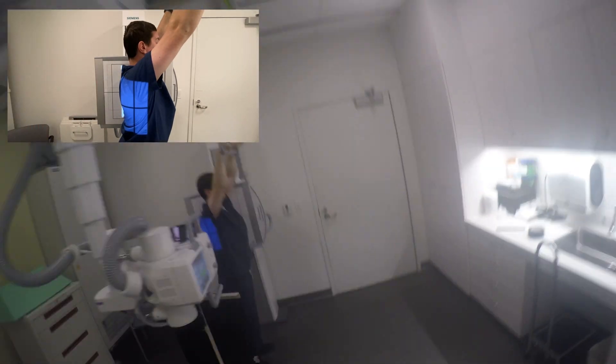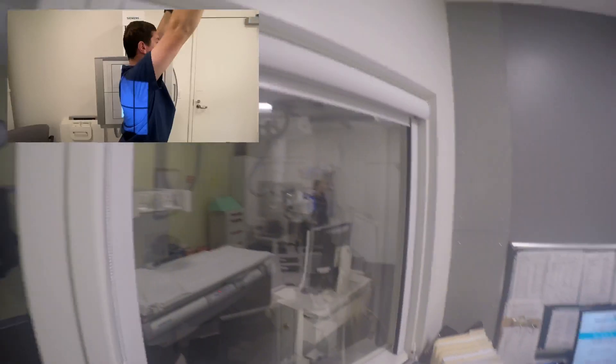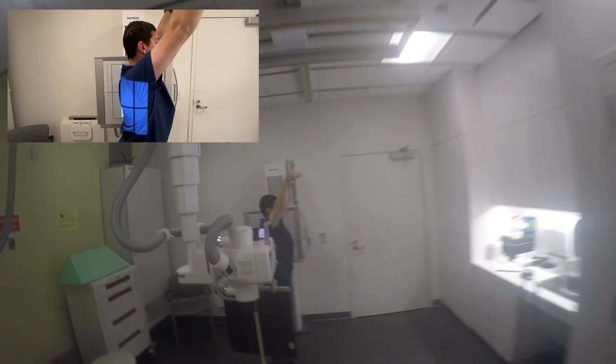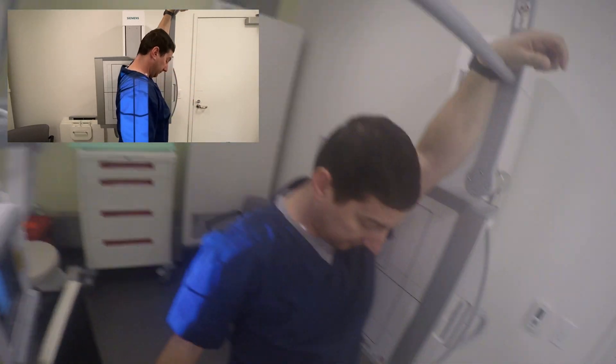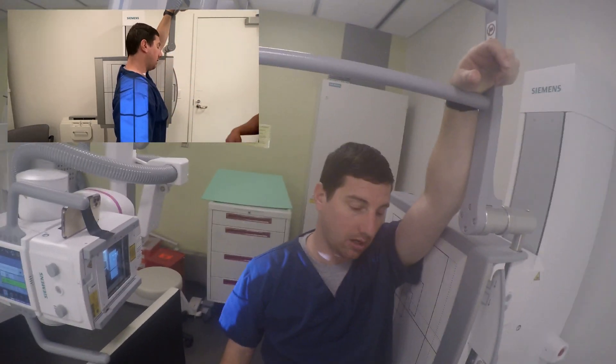Okay, just breathe normal. Hold still. Okay, so we're going to leave your left hand on the bar there. We're going to drop your right arm down to your side. And do you have any issues with your shoulders? Pretty flexible there? Yeah.